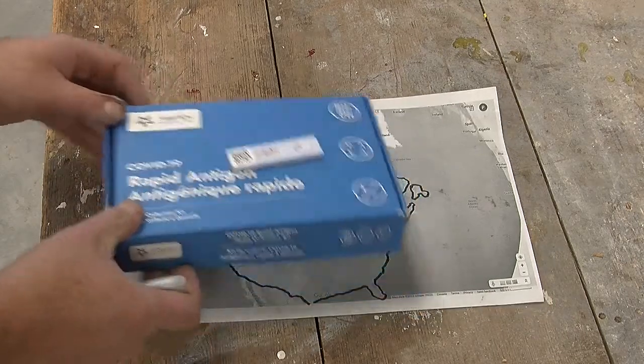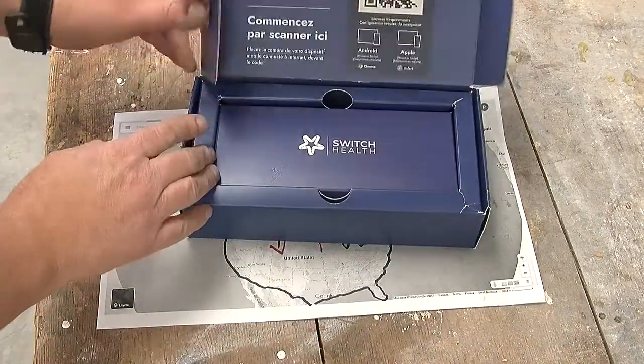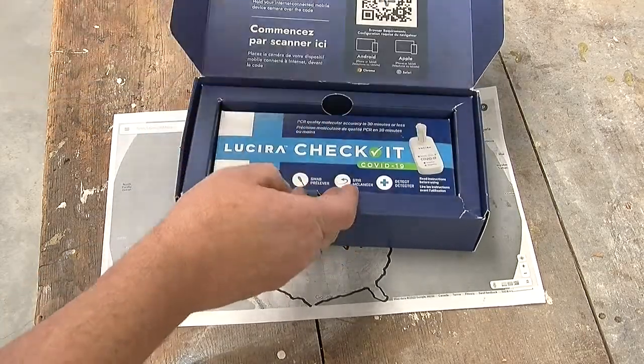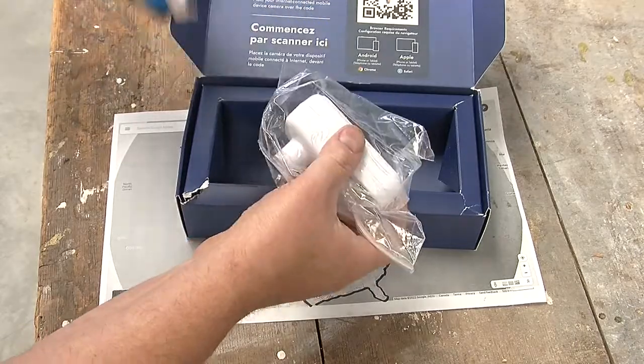But the really interesting test is this one, and as I said, it is the LAMP test. What it stands for is loop mediated isothermal amplification, and the RT part is reverse transcription, which is apparently used to make the test work on RNA from the coronavirus as opposed to DNA. Now, the amplification part is what is required to go into Canada, and normally you would use a PCR test where you'd send your stuff off to a lab and get the results a day later.